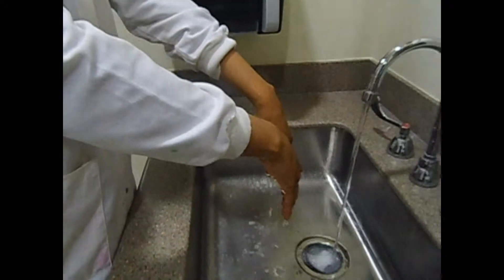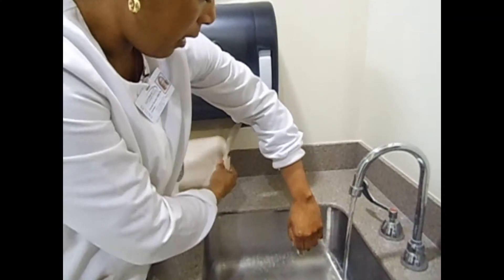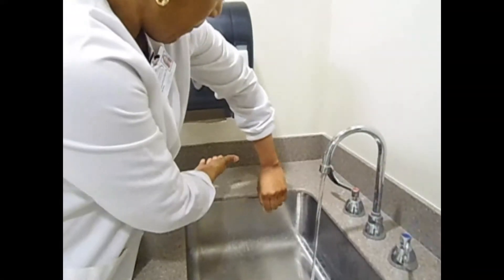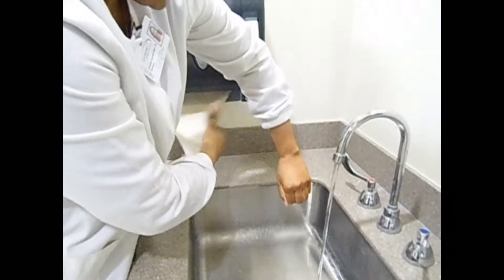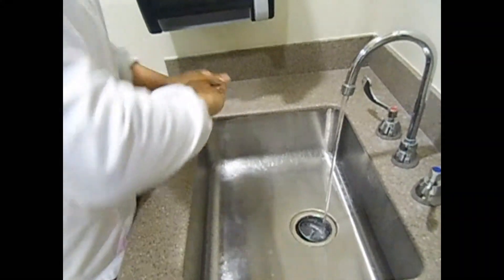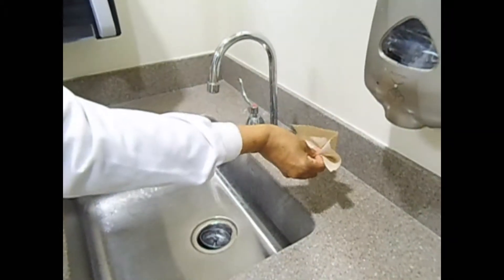Dry your hands with a paper towel. Using your elbow to dispense paper towels so you don't raise your hand above your elbow, dry from wrist down and discard. Repeat until your hands are nicely dried. Once dry, take a clean dry paper towel and turn off the hot water first, then the cold. Hand washing is now complete.